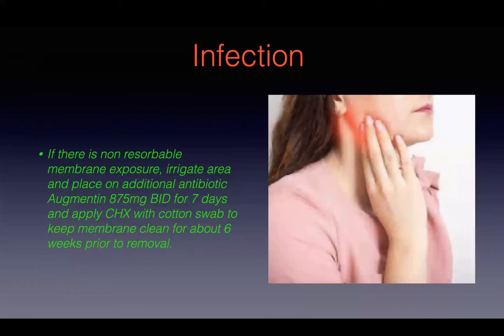And that was a little over 3 months ago. I typically have them come in for a 1 week post-op, a 2 week post-op suture removal, and then about 4 weeks to remove the non-resorbable membrane.